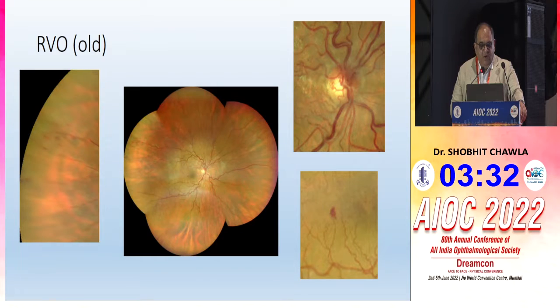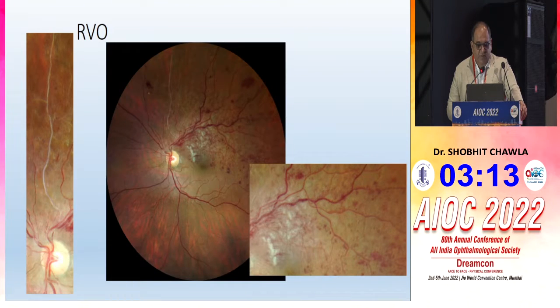In an old, dried out CRVO, you see this area with peripheral neovascularizations, collateral at the disc. You take a wide field image and then toggle onto the areas of interest with magnification, and you see so much information. Another case of retinal vascular occlusion.